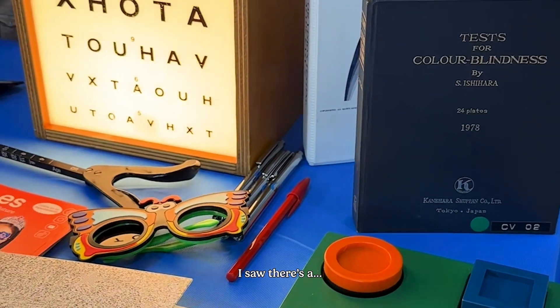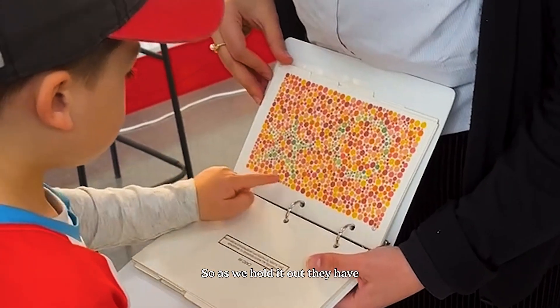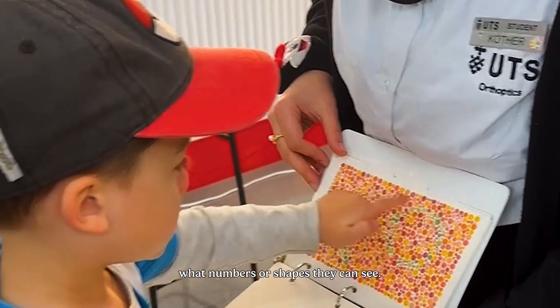And what else did you use? We have what we call a color blindness test called an Ishihara. We use this for younger children as it's easier to detect color issues like red and green defects. It has different plates, and with these different plates there are different numbers or different shapes, and we basically tell them what numbers or shapes they can see.